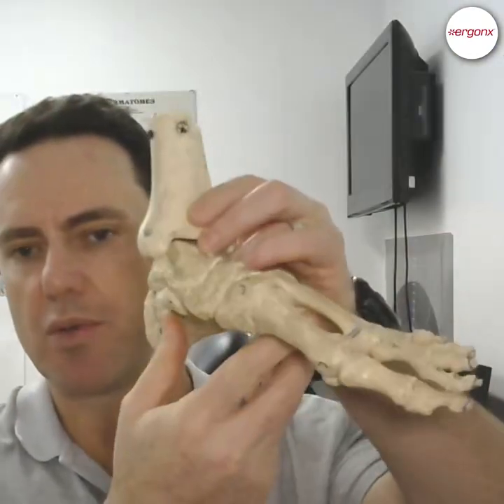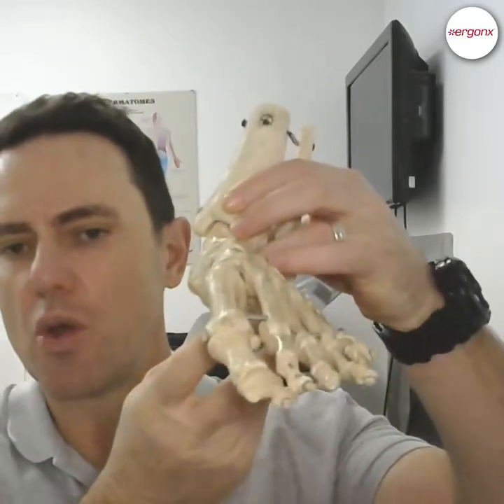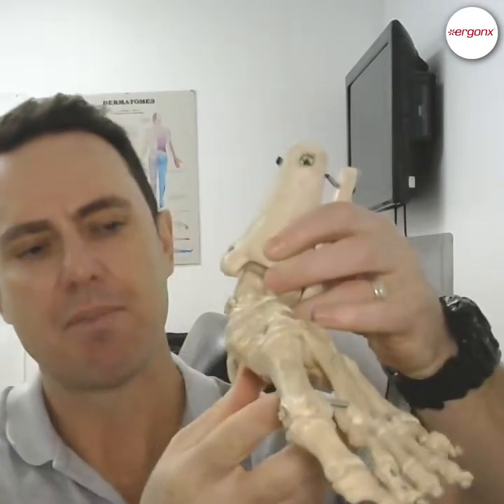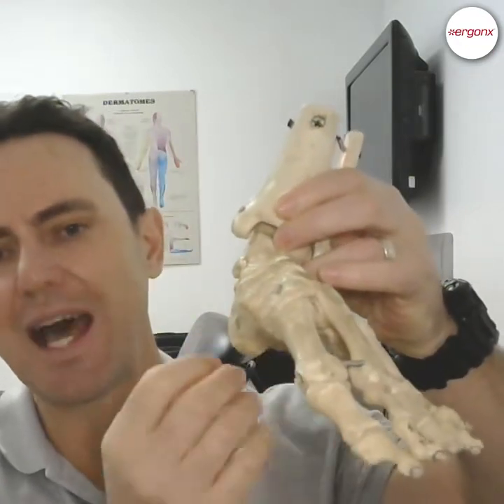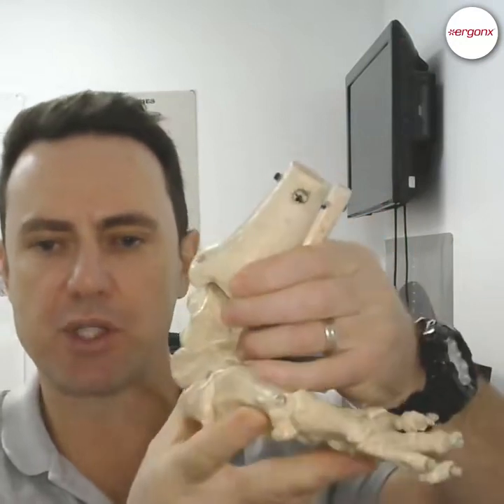The reason an overpronated foot is usually more susceptible to aches and pains and injury is if we look at the way the foot works. We've got a left foot here — this is the medial arch. What happens is when the foot hits the ground and pronates, basically the whole foot flattens out and all of the joints and ligaments unlock, and the foot becomes a very inefficient lever for propulsion.